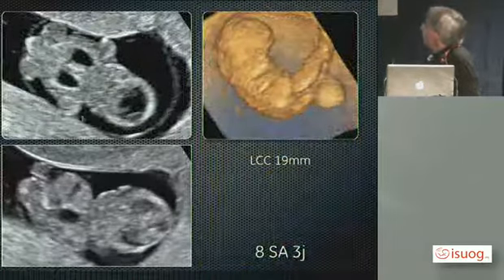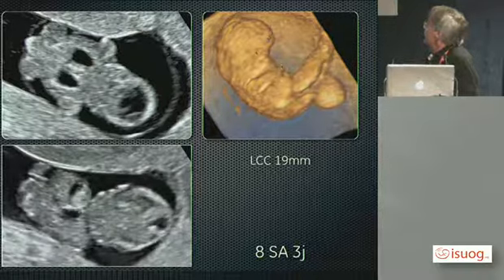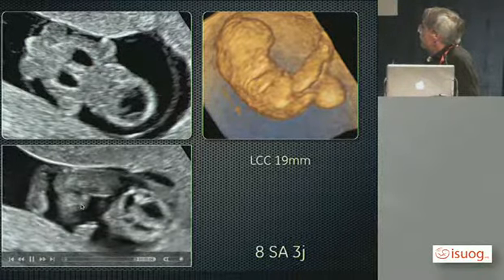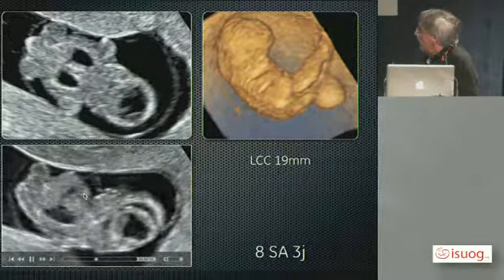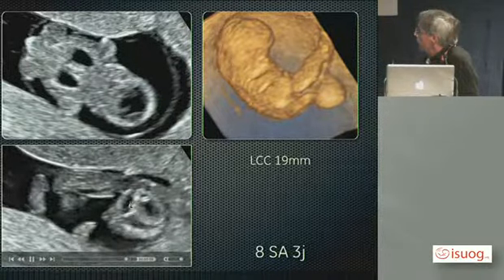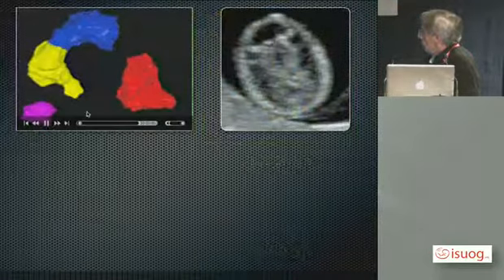Again, another hydrothorax here with an abnormal face. And look at this. You can see the heart is not in the correct position. It's a little bit too far outside. And also on the anterior part here, you have holoprosencephaly. This is the same with the 3D rendering.